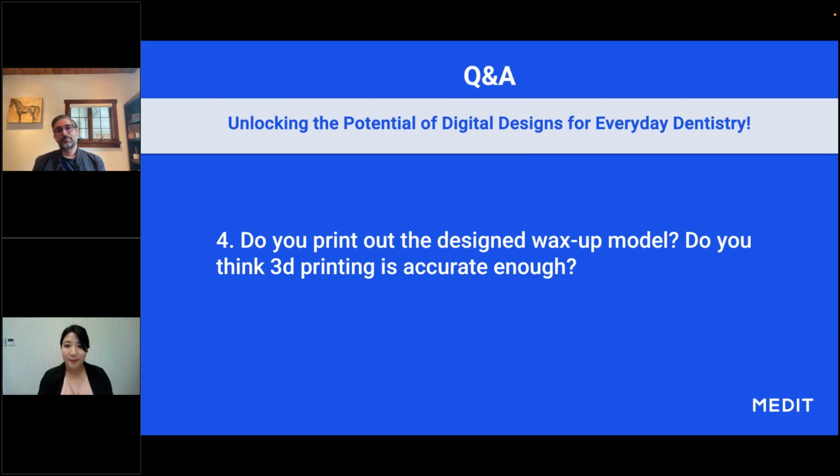Yeah, that's a good question, because that's exactly what we're talking about. I started with doing my digital designs, printing them, and then I would do my mock-up or my test run or my test drive, whatever you want to call it. I would use that model, make a putty from it, and do it in the mouth. As time has gone on, obviously there are some variations among printers, but the scan data is accurate enough. And I'm using SprintRay printers personally.